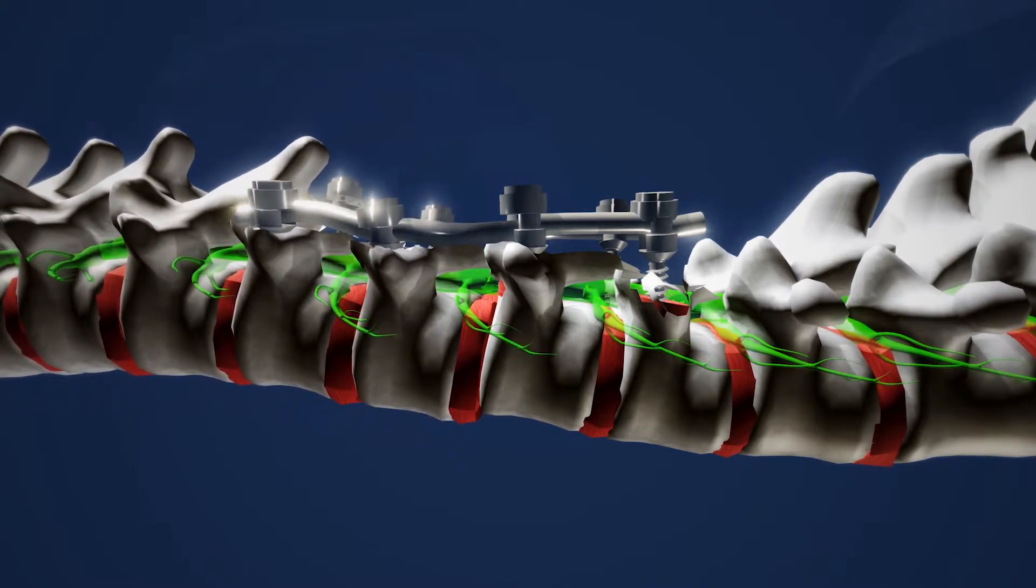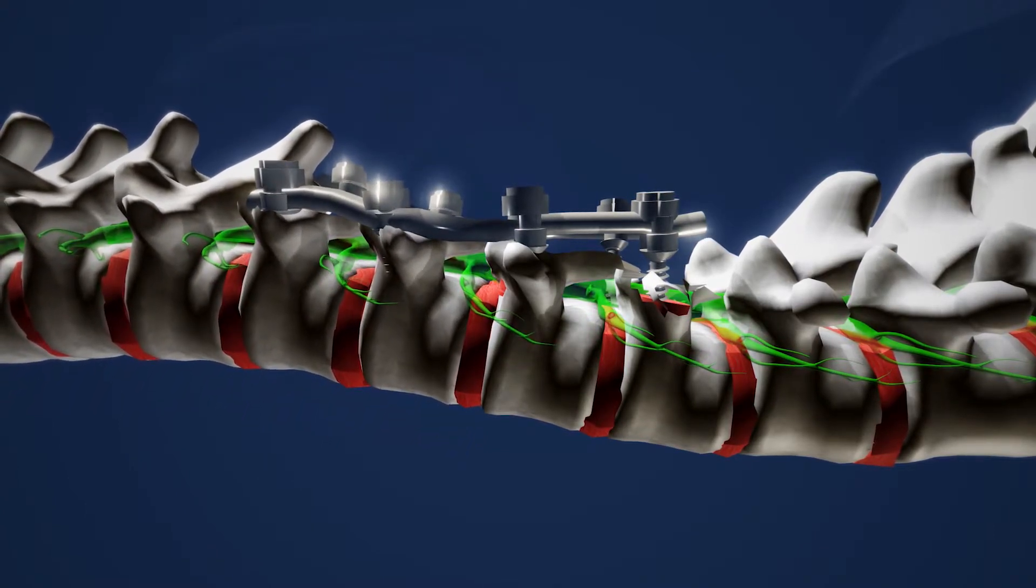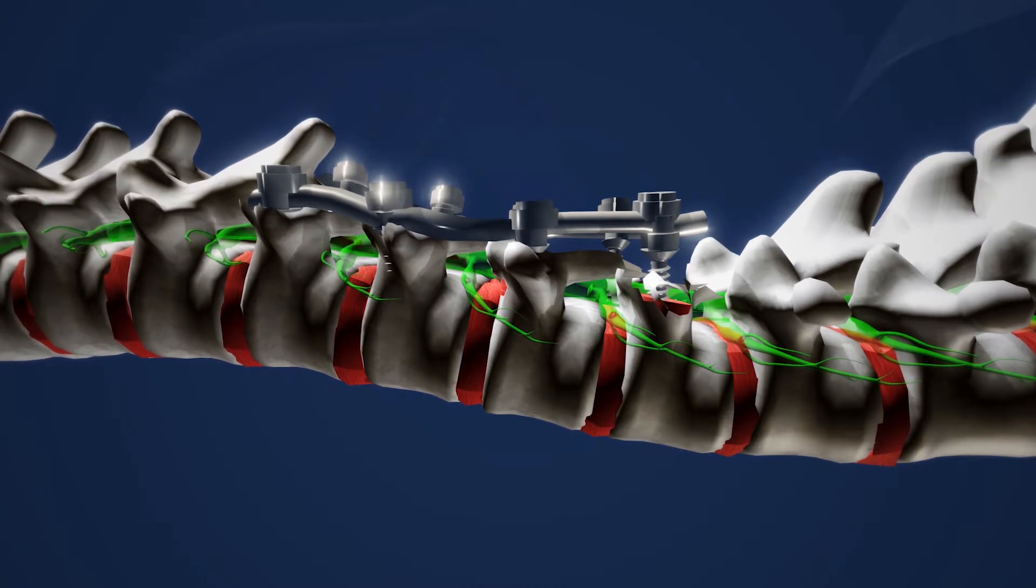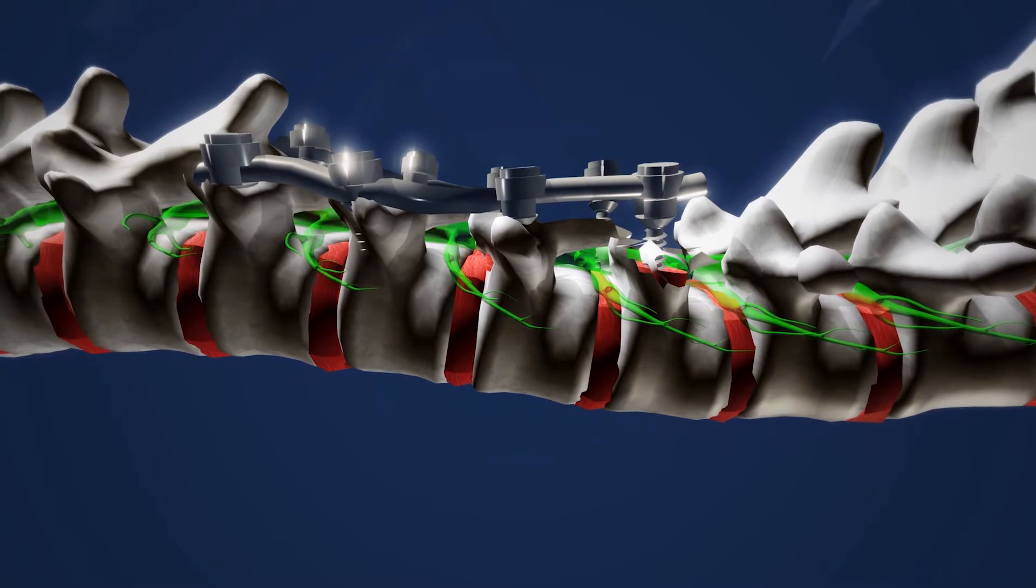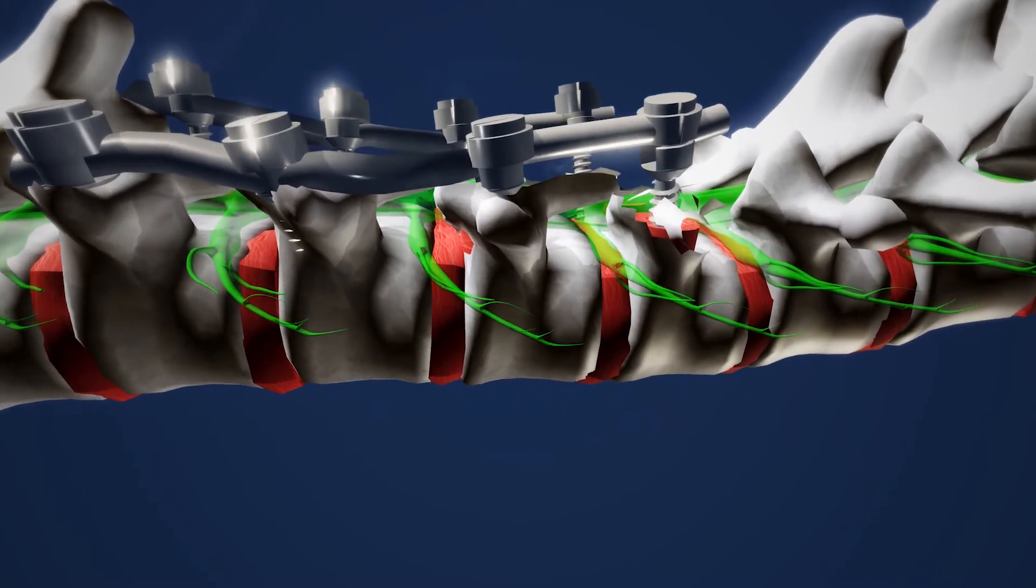Once we bring the spine back into alignment, we can lock in the screw rod construct and this is what will hold him together for his first year after injury while the bone grows together and heals.